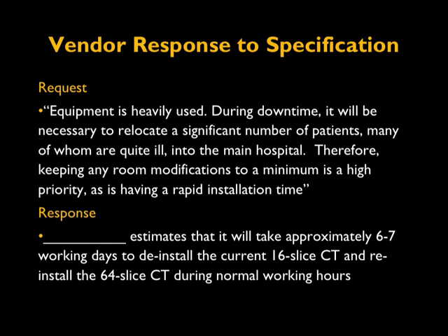The bottom shows the response from a particular manufacturer, basically saying it estimates that it will take approximately 6 to 7 working days to deinstall the current 16 slice CT scanner and reinstall the 64 slice CT scanner during normal working hours. So when we are comparing specification responses from the various manufacturers, this can be compared apples to apples across manufacturers to see which can do a very fast installation, and therefore cause minimal disturbance in the workflow of a clinic.